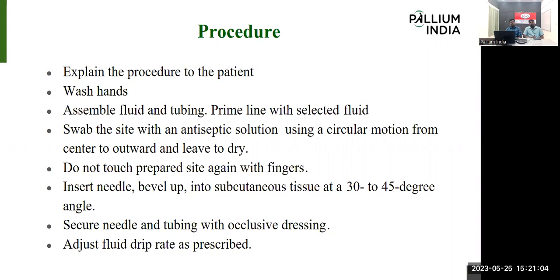While we are giving the subcutaneous injection or infusion, there will be a mild edema on that area. We need to explain that to the patient and the family, or otherwise they will misunderstand it, as with an IV cannulation area, where edema means the cannula is not right. They will have that same feeling in the subcutaneous area also. So we need to explain the procedure to the patient.